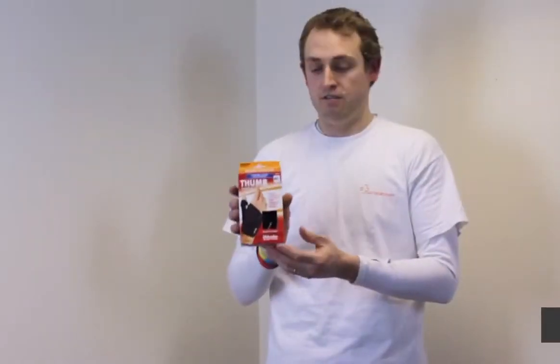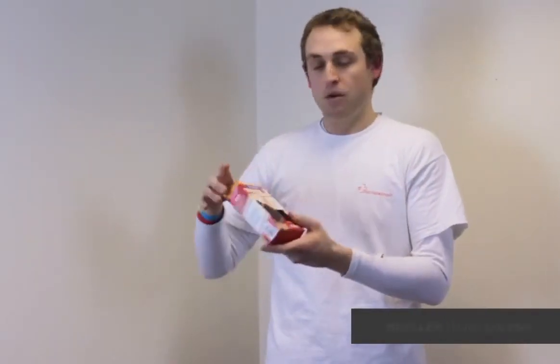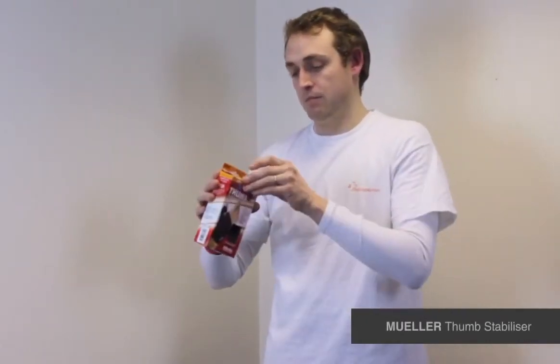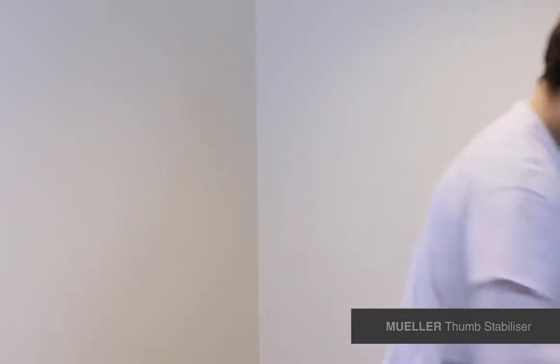I'm Michael Davison, Managing Director of First Aid for Sport, and this is the Muller Thumb Stabiliser. It's one of our best selling products because it's a one size fits most, left or right, so it's a must have in any physio kit.